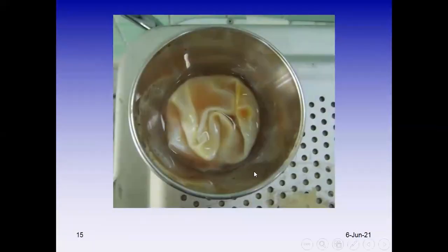That is the appearance of the laminated membrane of hydatid cyst, whether in the lung or in other locations. It is a white, thick, proteinous membrane, which is pathognomonic of the cyst.